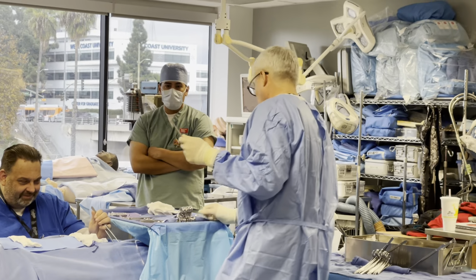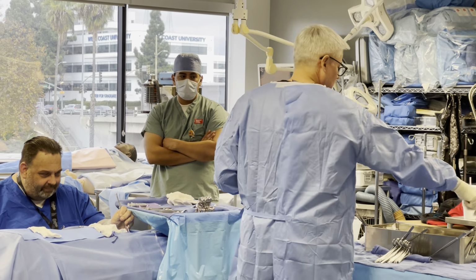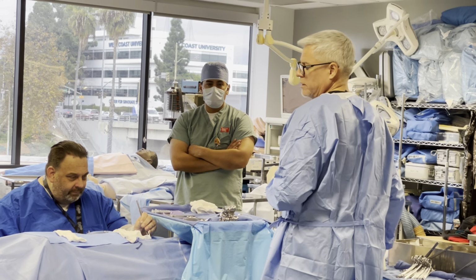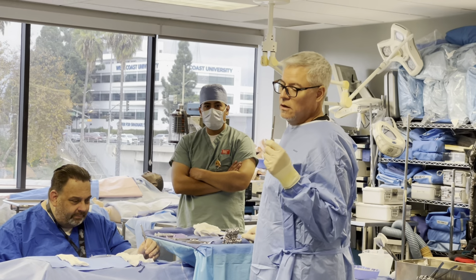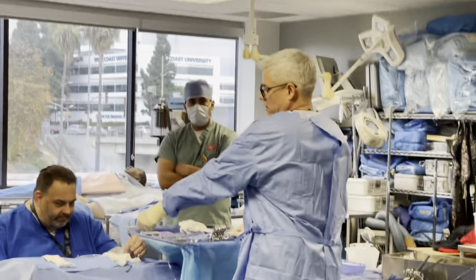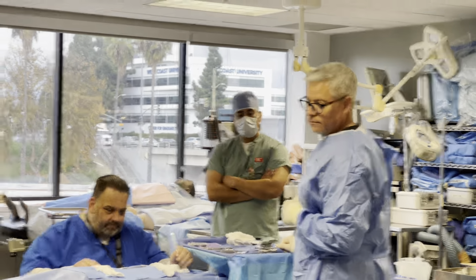Okay? If we use a knife to count things in the beginning, what do you think we should be using to count at the end? Speak up, you guys are so quiet. The scissors. If we're closing, what's the next thing he's gonna ask for? Your scissors. Cut.